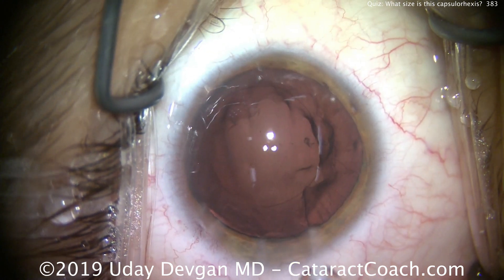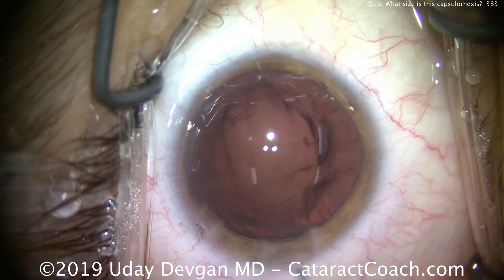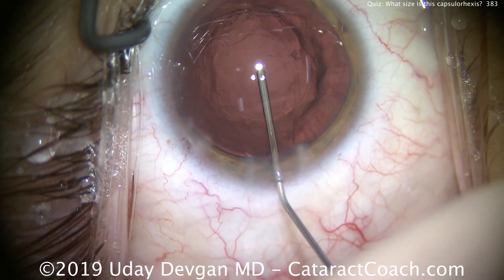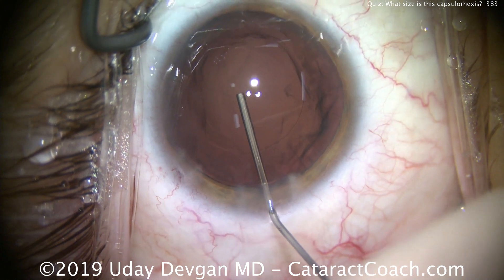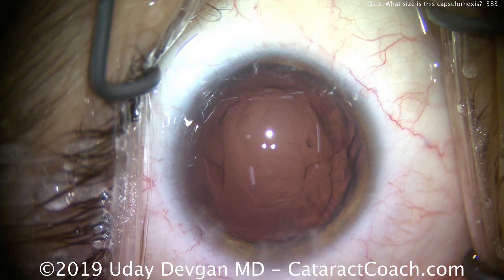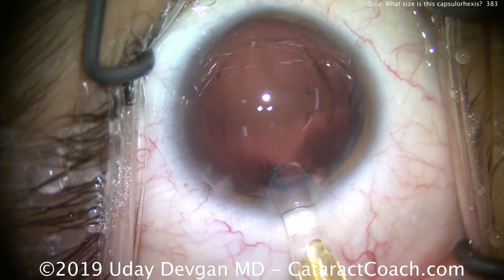Too small a rhexis can lead to phimosis of the anterior capsule rim and can also block some of the peripheral lens if the patient has large dilation. So let's fill up the capsular bag with our cohesive viscoelastic — and there we see the rhexis edge as the IOL comes in.